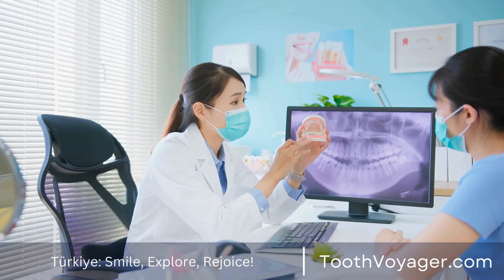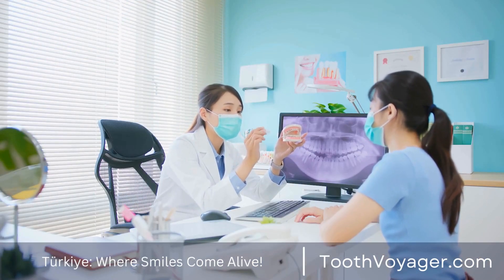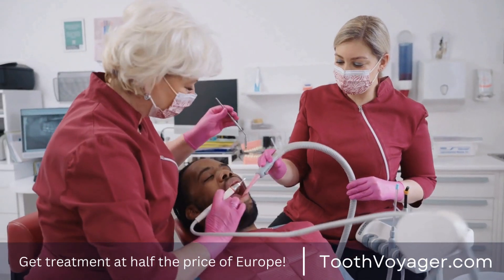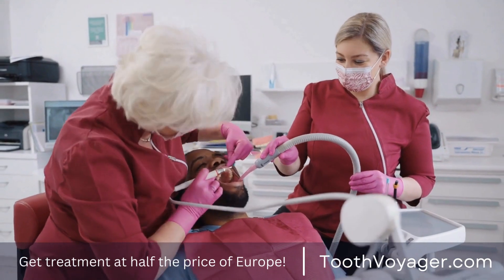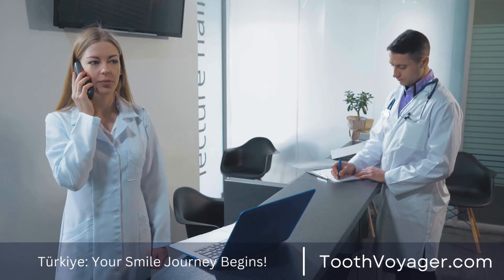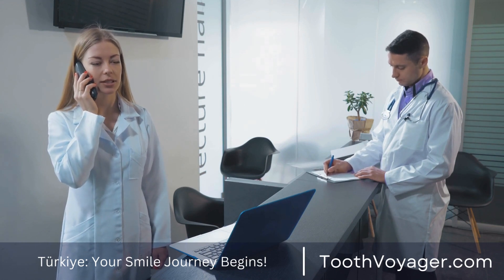Bonding: After the veneers have been prepared, the patient can return to the dental professional for a bonding procedure. The dentist will place the veneers over the tooth using a specific dental adhesive. The veneers will then be cured using a curing lamp, which aids in the hardening of the adhesive and secures the veneers in place.